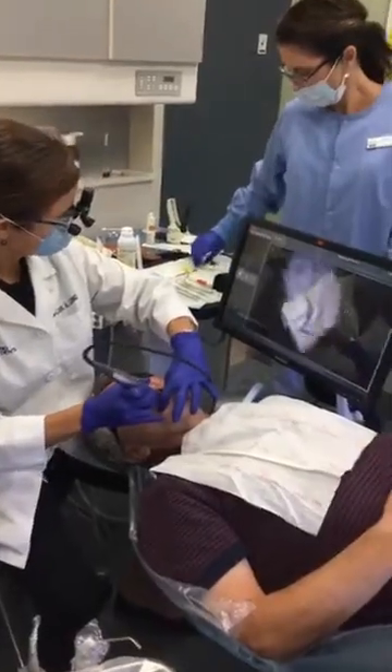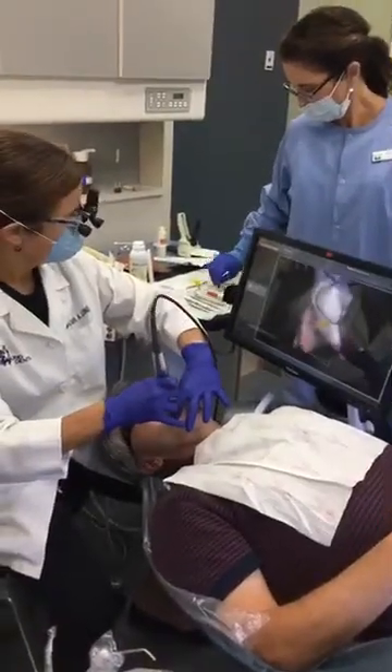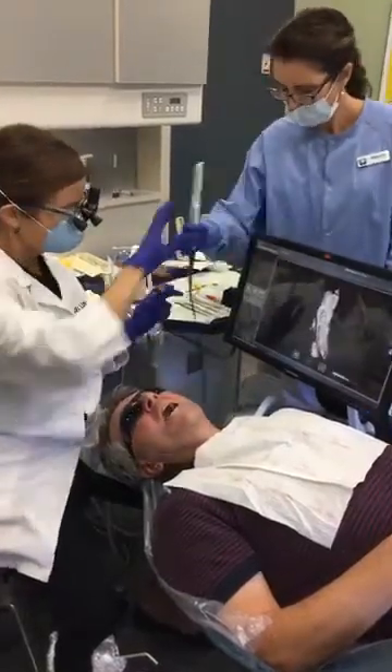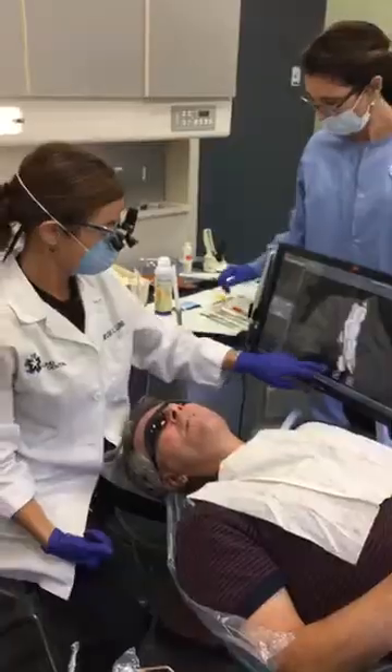So the powder you sprayed — is that what's picking up on the scanner? It is. It would technically pick it up even without the powder, but it would take a lot longer. So it makes it much quicker.